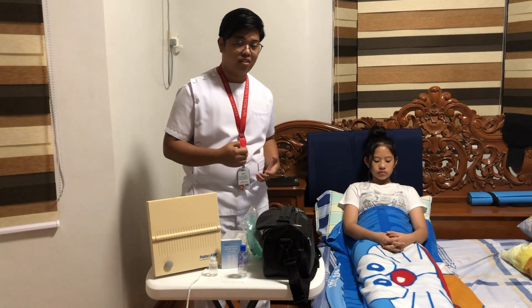And then afterwards, we need to put on our PPE, or also known as the personal protective equipment, as needed to comply with the standard precautions. And then afterwards, we need to obtain the patient's vital signs that can include temperature, the blood pressure, the heart rate or pulse rate, and the respiratory rate. And also, we need to auscultate the patient's breathing sounds, so that we will establish a baseline comparison for the later another assessment.